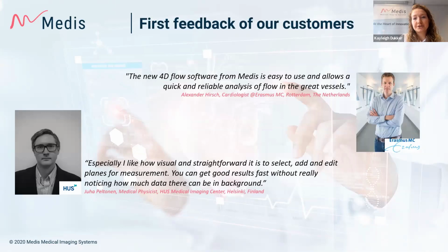So in our last release, we launched our 4D-Flow application, and we are very proud to present these two testimonials of our users. Their feedback was very promising for us.